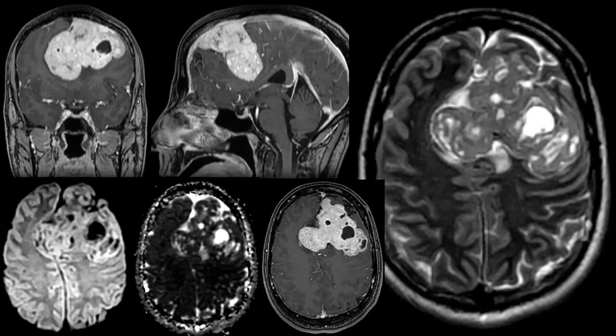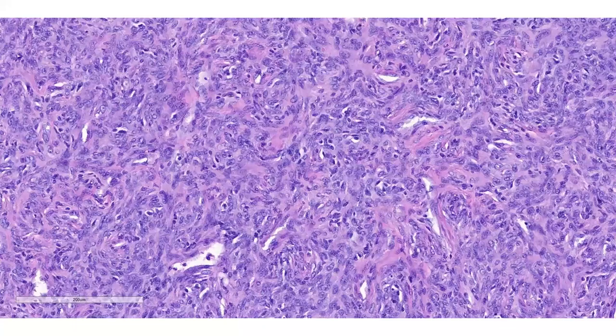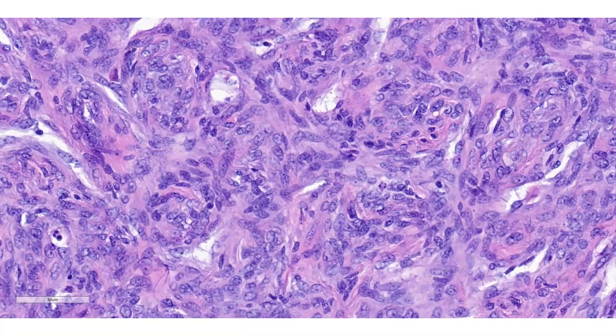Okay, we got one from the old school hemangiopericytoma, and we got one from the new era solitary fibrous tumor, and we are going to address that right now. Good job. Here's the histology. What is it? Higher power. Yeah, absolutely solitary fibrous tumor. Yes, you like that? Always, if you're thinking atypical meningioma because of the mushrooming, add in the same breath, or solitary fibrous tumor. And we're going to adopt the new WHO 5th edition, WHO 2021 convention. I'll talk about it in just a second. Hemangiopericytoma, I think, is finally going to sunset. We have been using both terms for about 5 years now, since the WHO 2016 came out. I think we're going to finally sunset hemangiopericytoma.